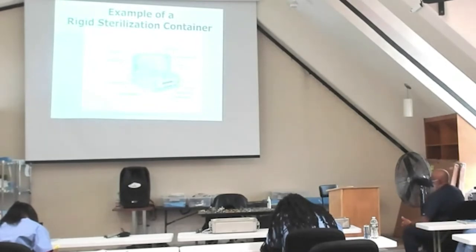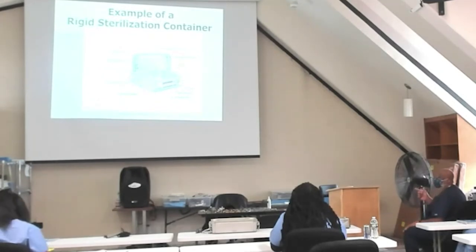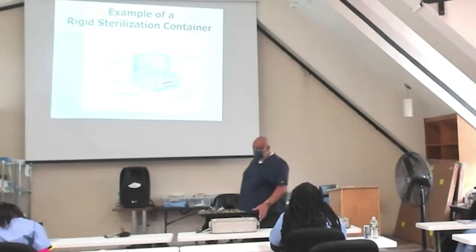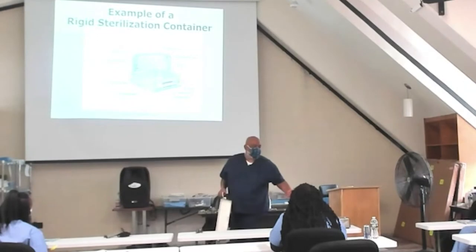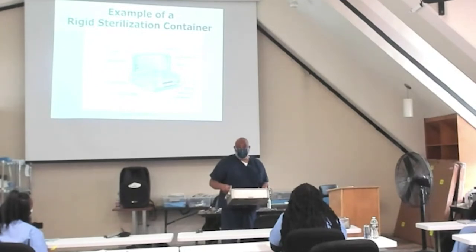So now we look a little more at the different parts of the container. It's important for us to be able to identify the different components, because we want to get the most out of it. All right? There are a couple of ways that we put it together and how we carry it. Never, never do this. We don't carry them like this, never. All the instruments that you assembled so nicely in the tray have now fallen apart and they're everywhere. And we're putting an extra burden on the handle. So we always carry them appropriately, okay?